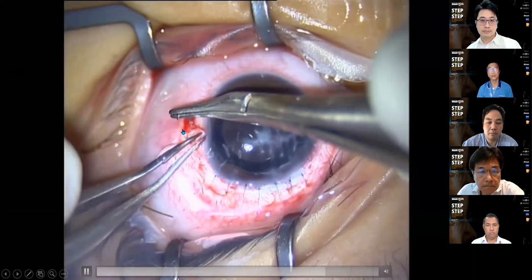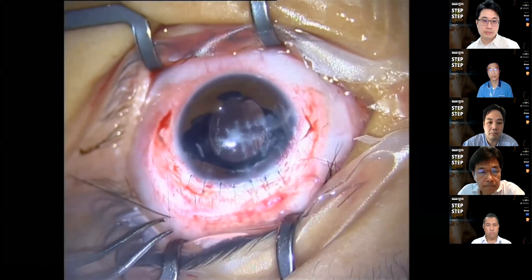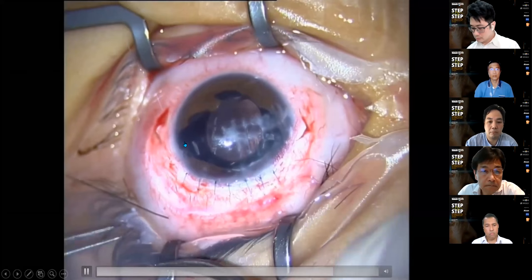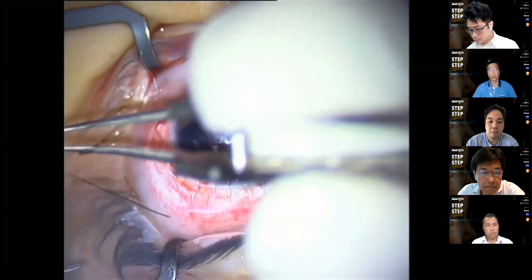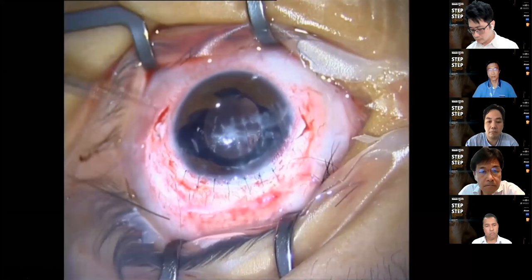The balance of that suture with the curved needle, I will use it to create a base for tying the knot, tying the suture that belongs to the trailing haptic of the IOL. This suture to itself forms a base, and then you suture it to the suture that is holding the other end of the haptic, the other haptic.